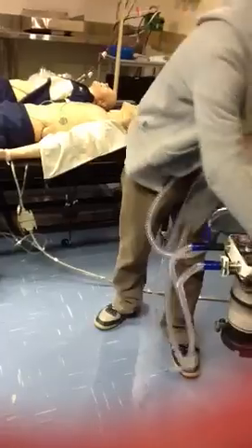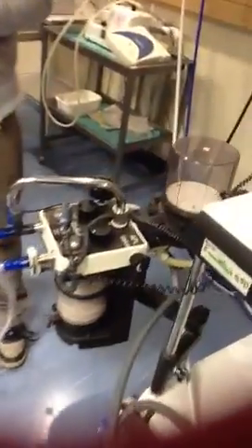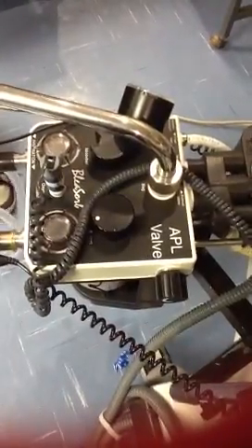So you close the APL valve. APL stands for adjustable pressure limiting valve, but we still use it as the APL valve.